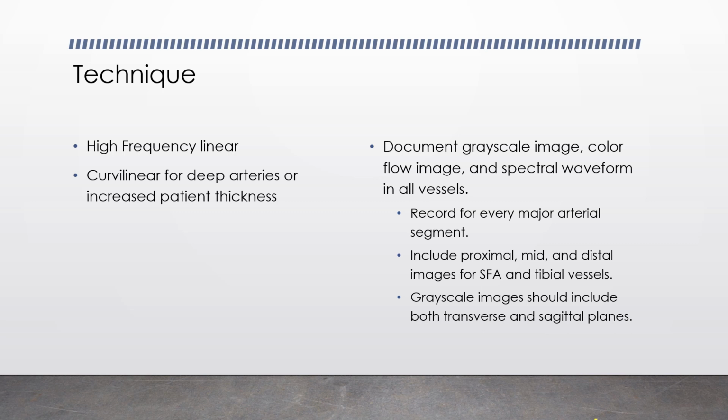Now, when you're working your way down the leg through the vessels, we're going to start at the common femoral typically, although if there is concern, you can start at the common iliac. So let's say you're starting at the common femoral right there at the groin, and you're going to evaluate the common femoral and its bifurcation into the profunda and the superficial femoral. You would evaluate that at the bifurcation level in long and in transverse, and you would document it in B mode in long and in transverse.